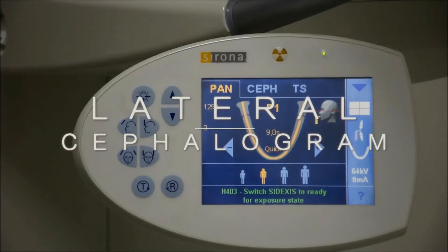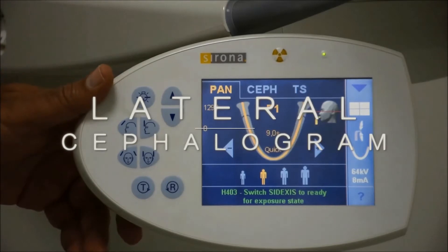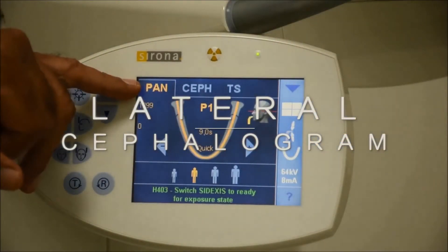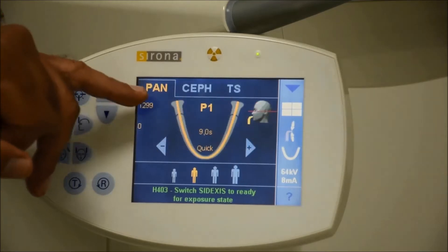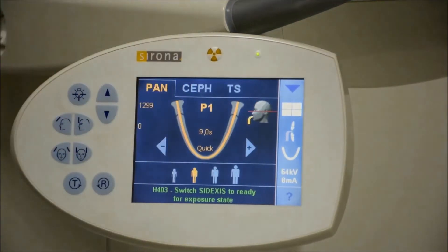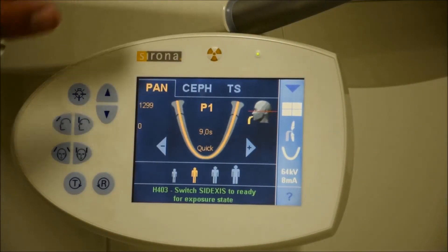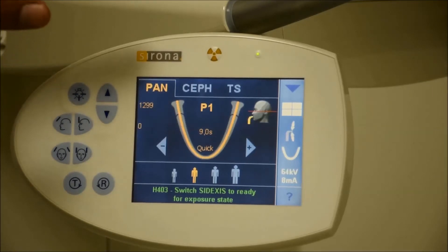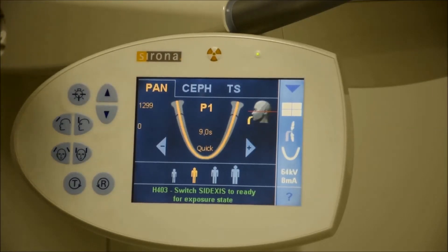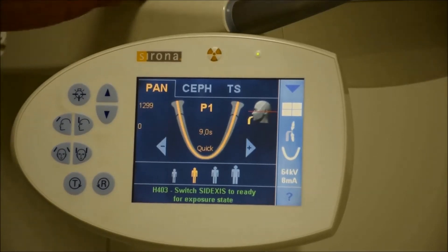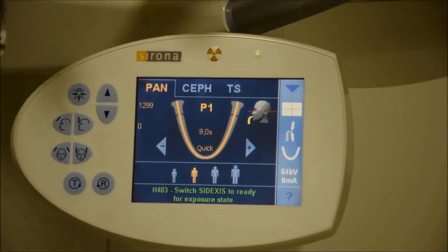Beyond the panoramic mode, we can also take two or three other modes, including the lateral ceph. You can activate it through SIDEXIS the regular way, the same way that we have activated the machine for panoramic exposure.